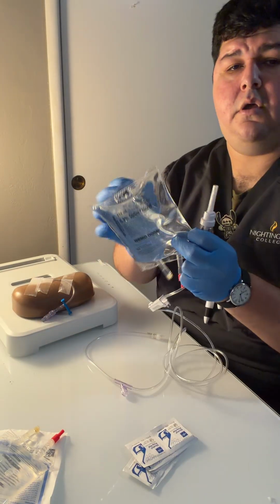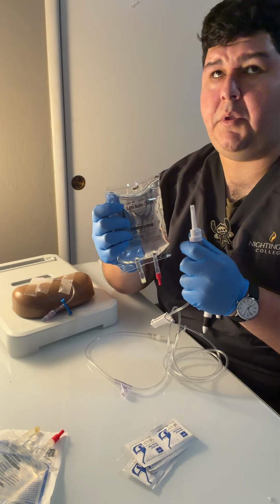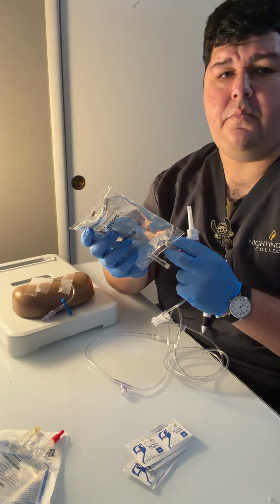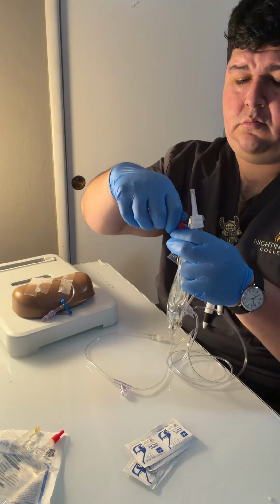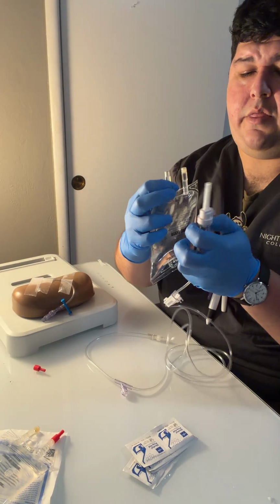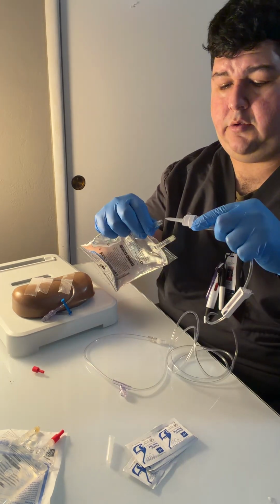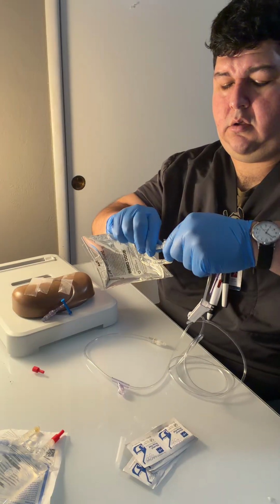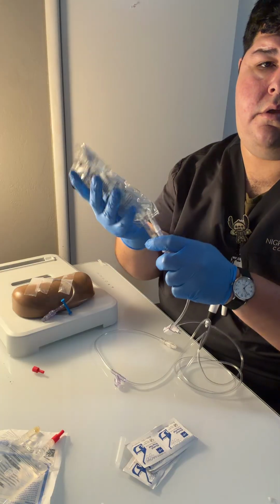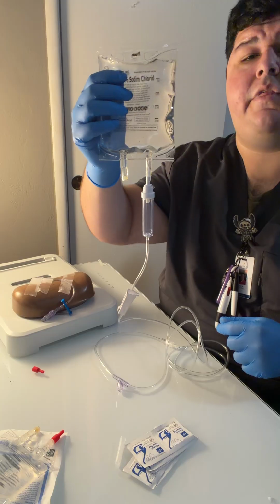I should have it correct, which is our 250 ml. This is the IV solution that we're starting first. Want to remove the top there. And then again, this part is to remain sterile. Remove the top. And then go ahead and introduce that into the bag all the way in. And we have our spike of the IV bag.